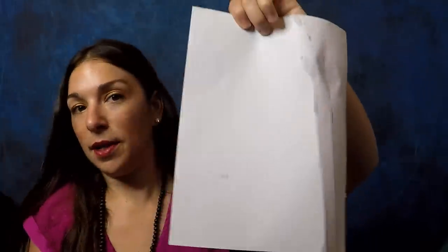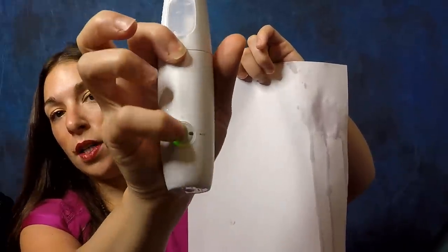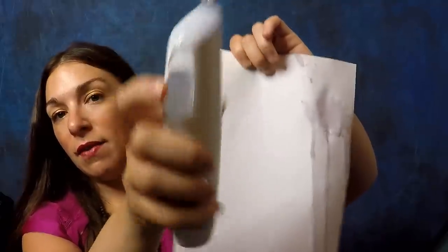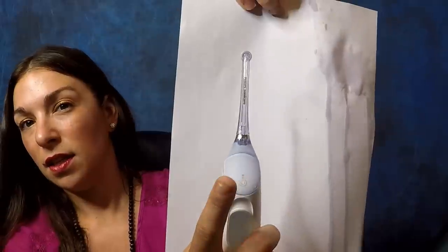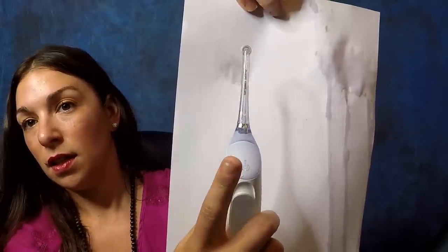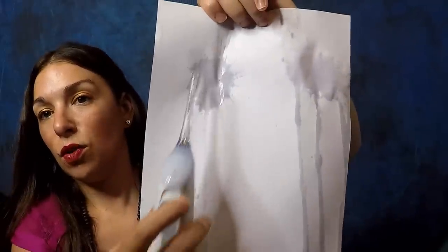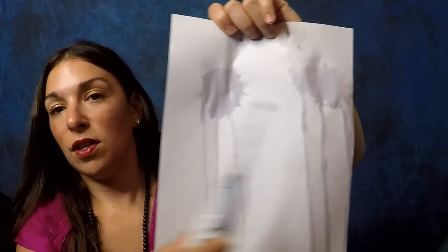Now I'm going to compare it — I'm going to set it to three bursts. You can change it to one, two, or three. I'm going to spray here so you can see. This one feels more controlled; it doesn't seem to spread as much water everywhere.